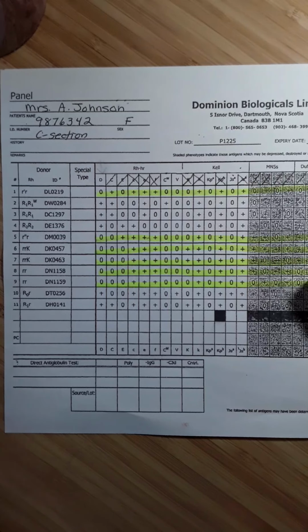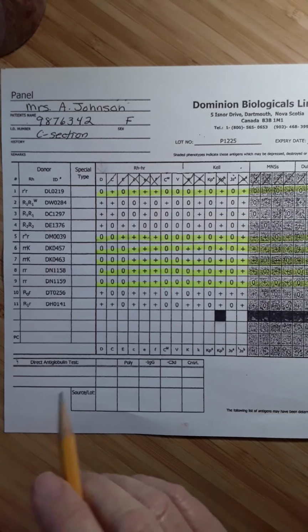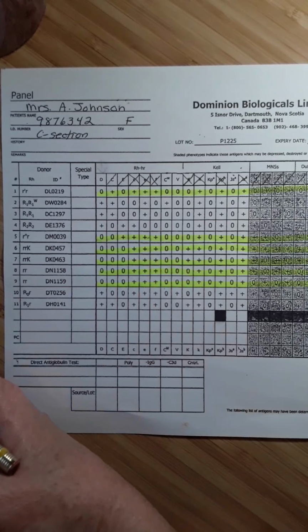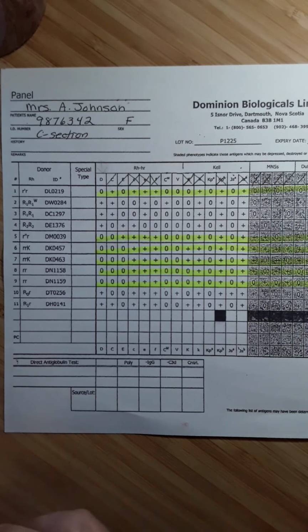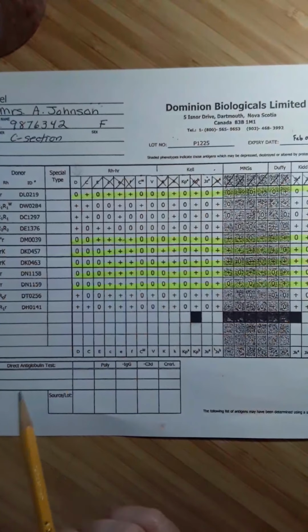Okay, you guys, how did you do on this? When I left you, you were going to work across, starting I think at CW, and determine if you could cross out or exclude any further antibodies from this patient, Mrs. A. Johnson. So let's see if you got the same thing that I've got.